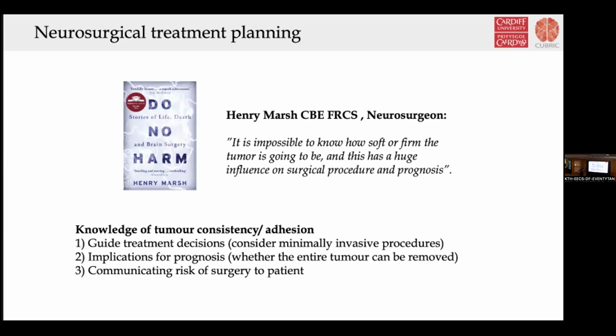And I remember reading a book a couple of years ago, and it said it's impossible to know how soft or hard a tumour may be, but it'd be great to know this because it has such a huge influence on the surgical procedure. I thought, well, this technology is available. Why is it not being used?